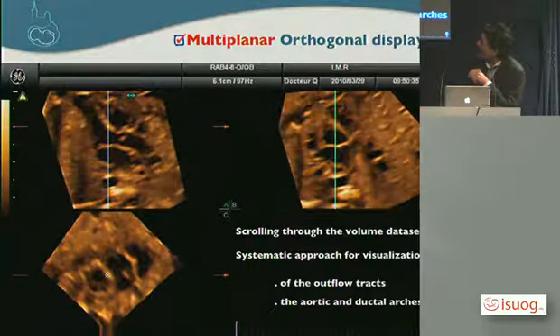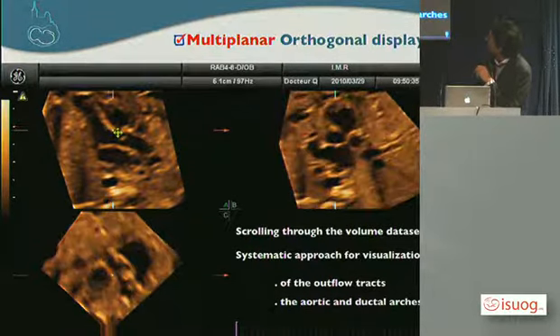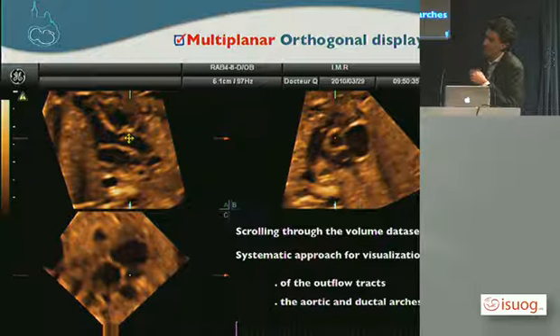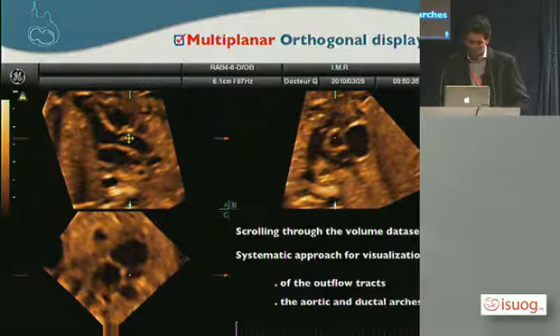You can see just here the mitral continuity, the septo-aortic continuity, and here just afterwards, I hope so, the right ventricular outflow tract. These are algorithms that are very well demonstrated and explained in a very rich literature.